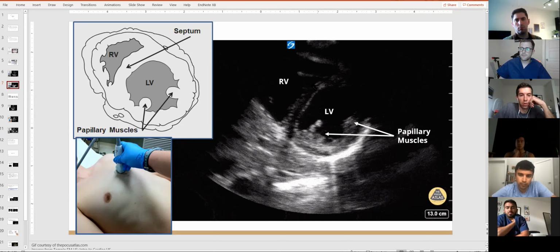And the reason why is the interventricular septum here is muscular. If you go higher, it's not muscular anymore. And so if you want to talk about wall motion abnormalities and squeeze, you need to be at a level where all of it is muscular. So this is a nice round view. If you get off axis, meaning it looks like an oblong shape, it's really going to mess with your perception of the ejection fraction as well as the walls. And so you really want to make sure that it's nice and circular, and then you're cutting it nicely right at the mid-papillary level for the parasternal short.